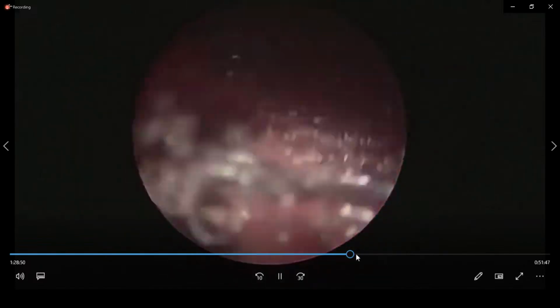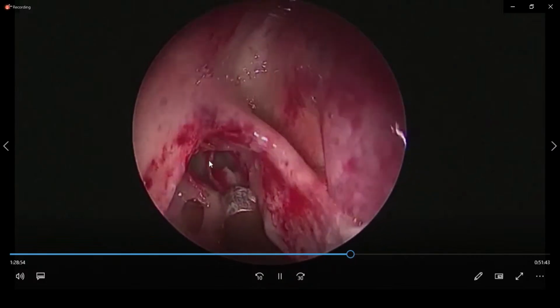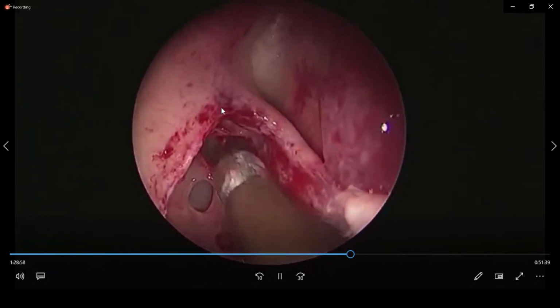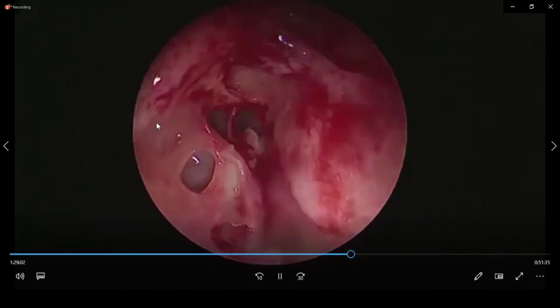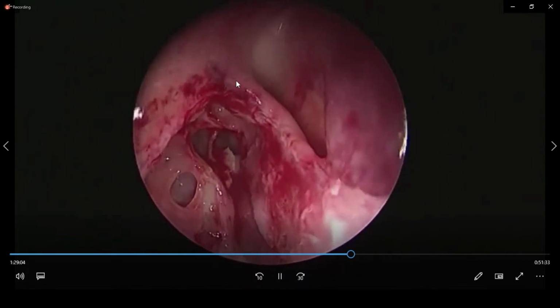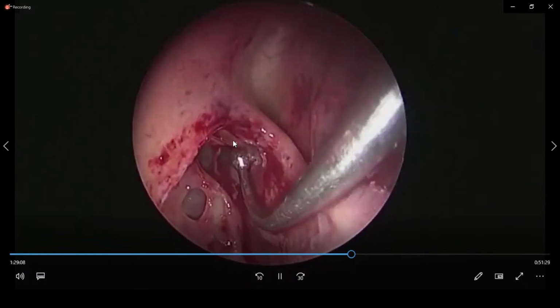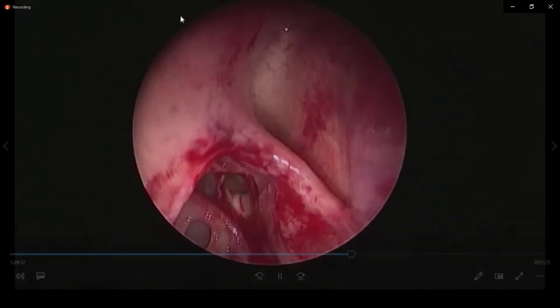So this is the, see carefully. It is an easy way to follow the beak. You follow the beak, and usually you can go to the sinus. When you follow the beak between the lateral and medial wall, close to the beak, that will lead to frontal sinus. In case of huge type 3 cell, it can confuse you.